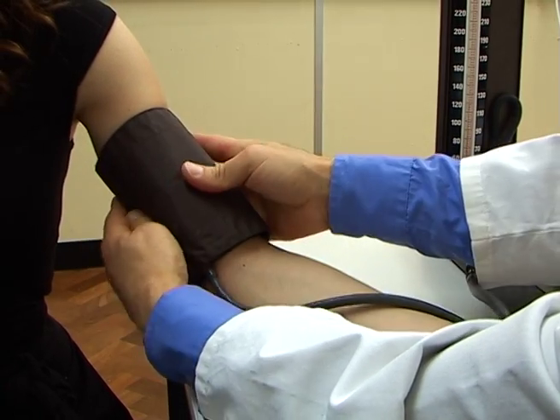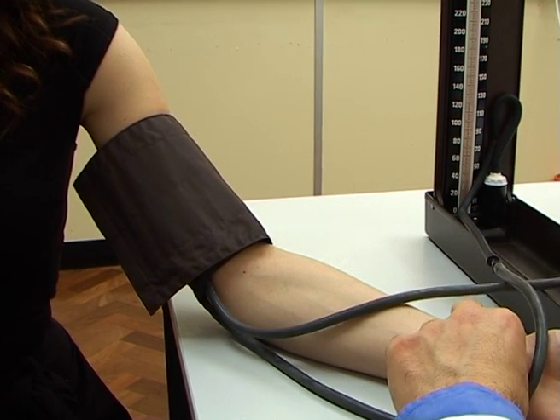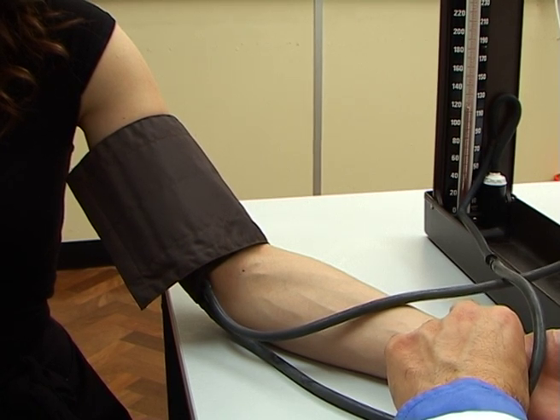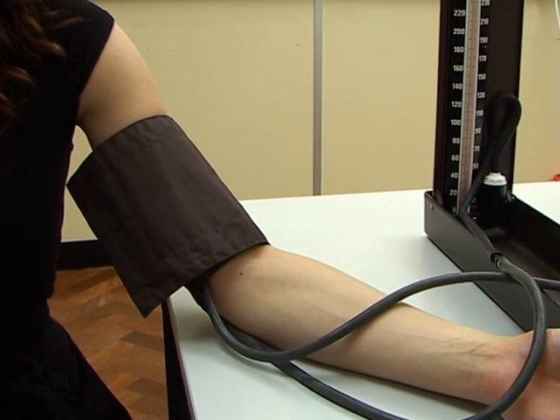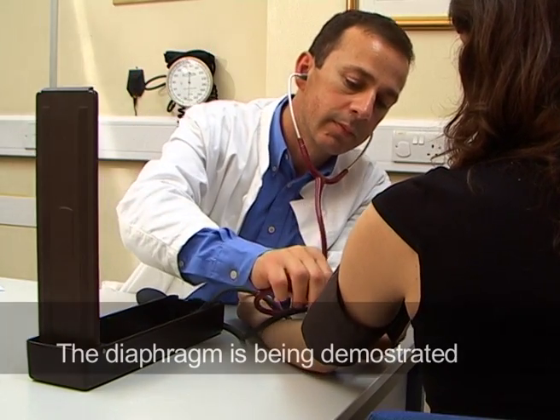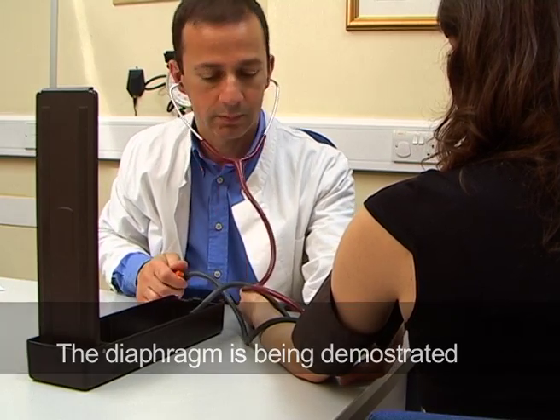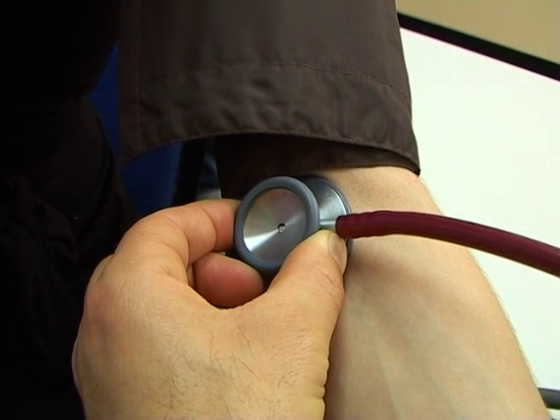Students should practice by pumping up the cuff and feeling for the radial pulsations until they disappear. Note the level of mercury at which the pulsations are no longer felt. Then deflate the cuff and wait 30 seconds, then start again. Position the stethoscope's headpiece in your ears and place the bell over the brachial artery. Pump up the cuff to a level of about 10 to 20 millimeters above that which you noted before.